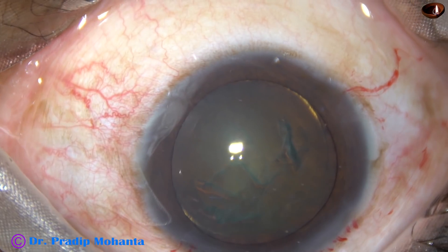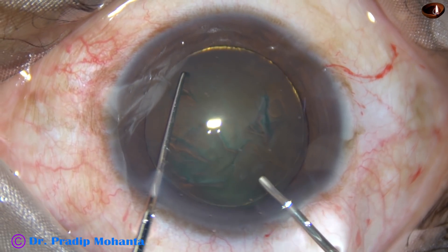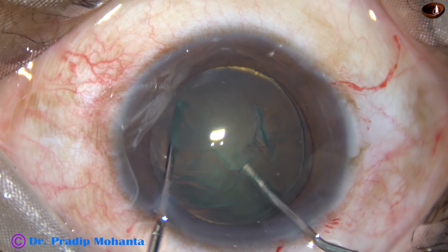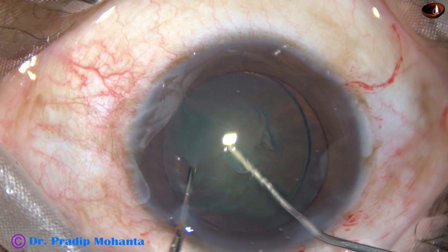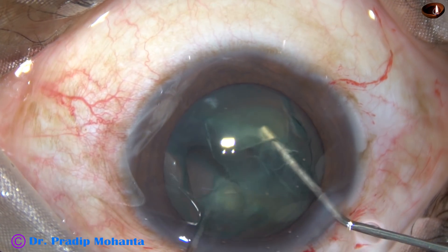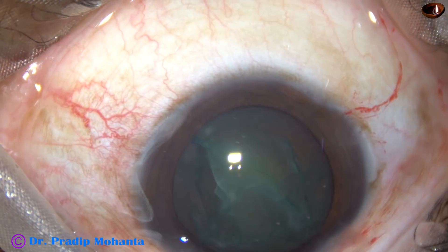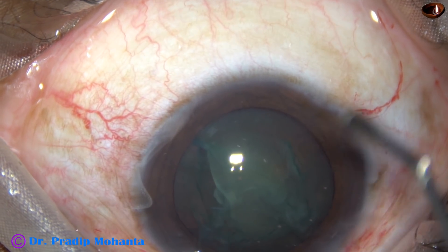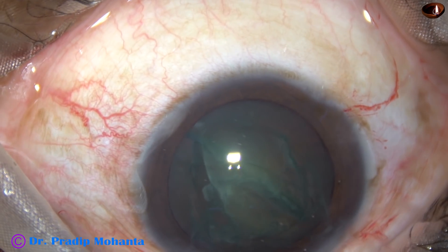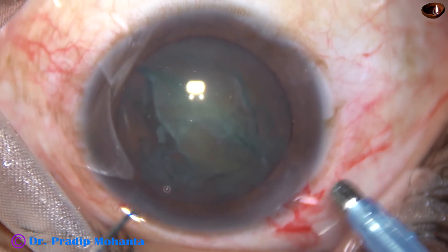I take the chopper in my left hand and the 27G hydro cannula in my right hand. The hydro cannula goes through the nucleus. The chopper comes from the opposite equator towards the hydro cannula. Both meet at the central area, and by lateral separation with opposite forces, the nucleus is divided into two halves.